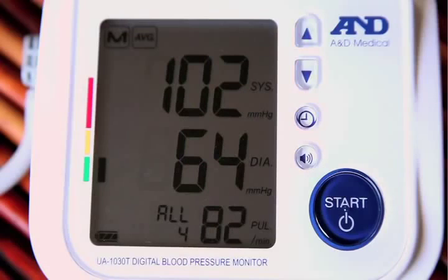Your systolic pressure is 102. Your diastolic pressure is 64. Your reading is normal.